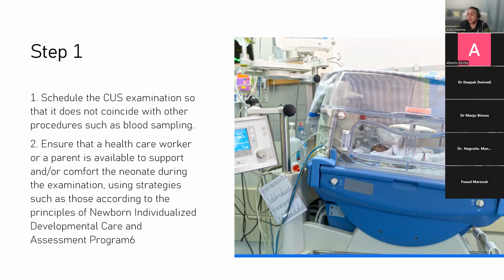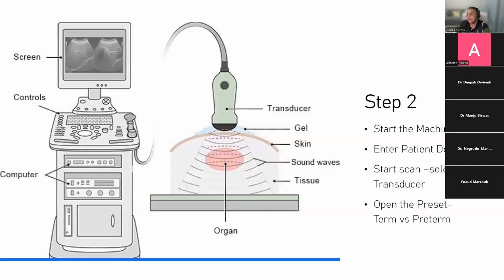So have a powwow, discuss when and how you're going to do the cranial ultrasound and with whom, and make sure that the baby has got adequate sedation and comforting. The baby is swaddled where appropriate, has sucrose, or has had a feed.